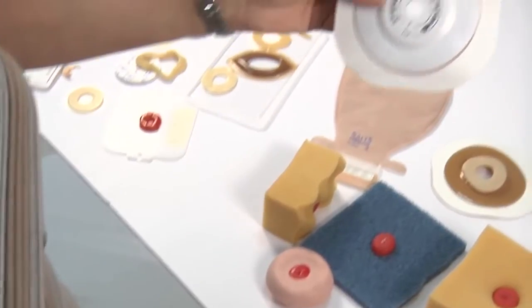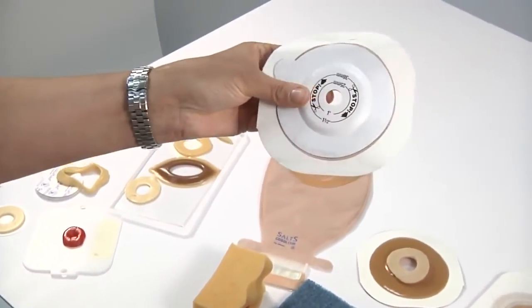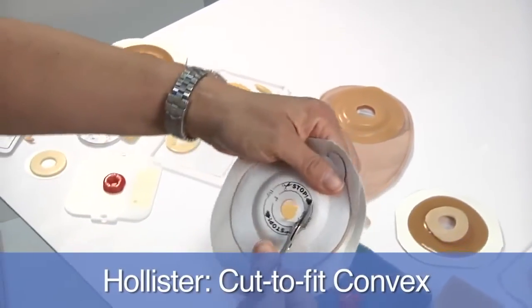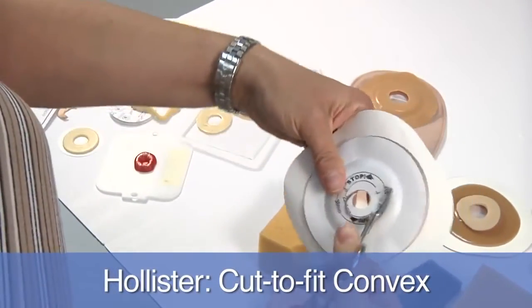As I said, there's two options available, and this is their cut to fit convex. So with this one, you would actually, as I said, cut it to the shape or size that you need.